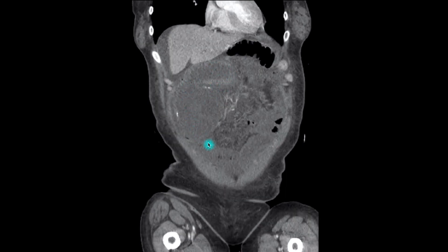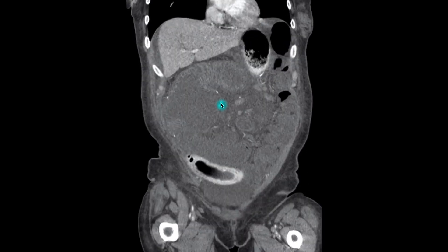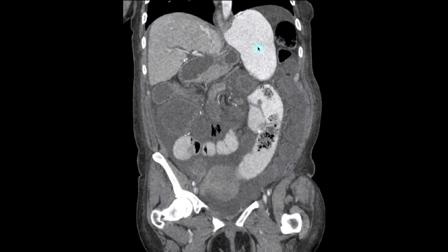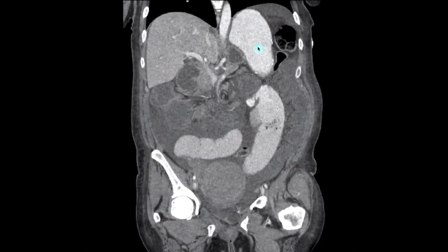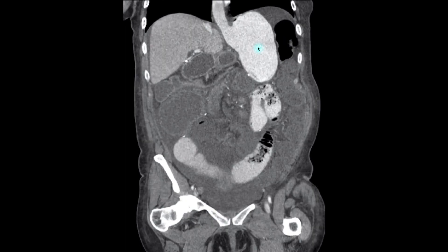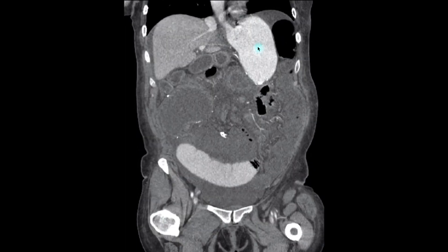This dilated loops of bowel is anterior and to the right of the abdomen. Moving back posteriorly, we see the esophagus and the gastric pouch. These suture lines indicate the gastro-jejunostomy.